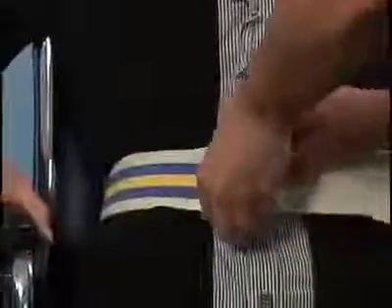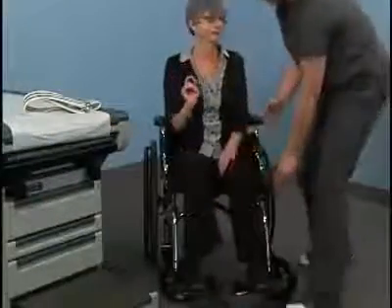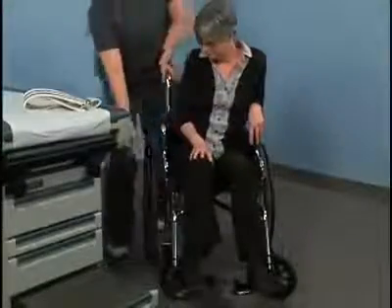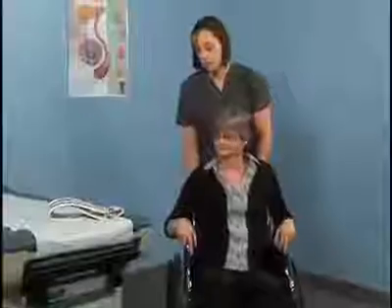Remove the transfer belt and make sure the patient is comfortable. Reposition the footrests and help the patient place their feet on the footrests and unlock the wheelchair. Push in the footrest of the examining table. Wheelchair transfer is not usually charted. However, please note any significant findings such as weakness or unsteadiness.